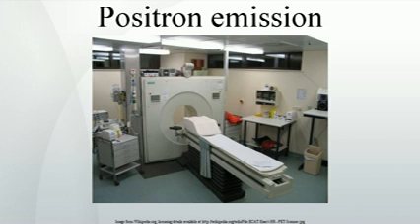Organic radiotracer molecules that will contain a positron-emitting radioisotope cannot be synthesized first and then the radioisotope prepared within them, because bombardment with a cyclotron to prepare the radioisotope destroys any organic carrier for it. Instead, the isotope must be prepared first, then afterward, the chemistry to prepare any organic radiotracer, such as FDG, accomplished very quickly, in the short time before the isotope decays.